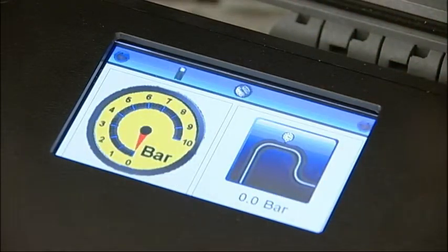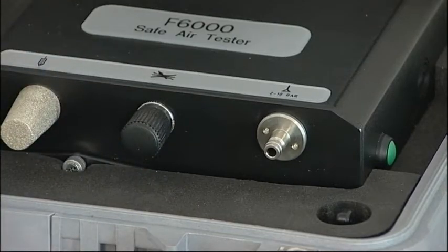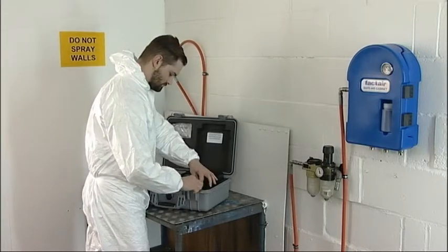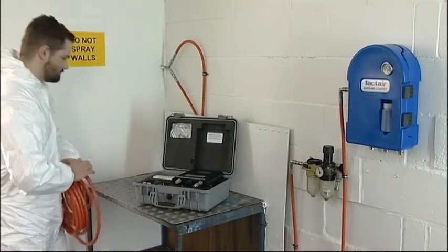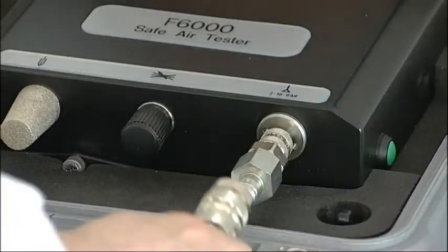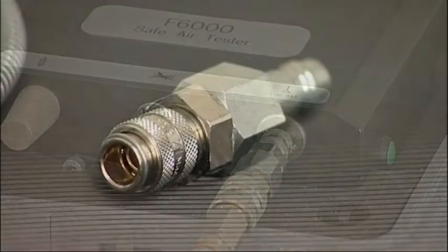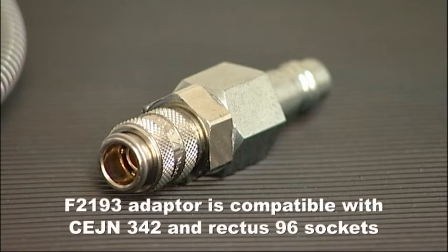When checking an airline system, ensure that the flow control valve is fully closed and then connect it to the air supply to be tested. Ideally, this should be done by using the hose which normally supplies the breathing apparatus. Fit the appropriate adapter to the tester first and then connect the supply hose to the adapter. As standard, the F6000 is supplied with an F2193 adapter which terminates in a CEJN-compatible plug.